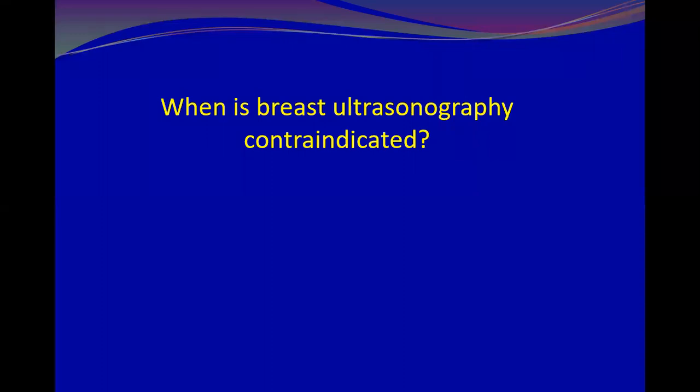Any contraindication for ultrasound? Can you imagine a contraindication? In case the skin overlying the breast is extremely ulcerated, or for fungating tumor masses, or for inflammatory process. No, we have done a lot of ultrasound in fungating tumors.